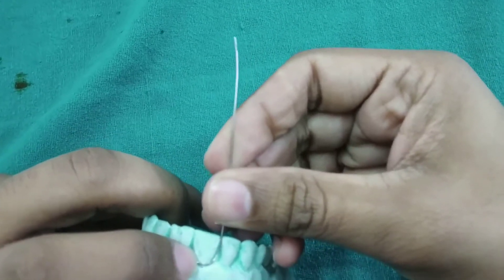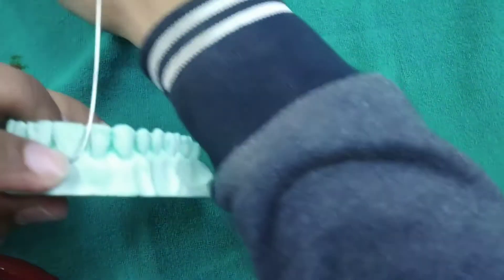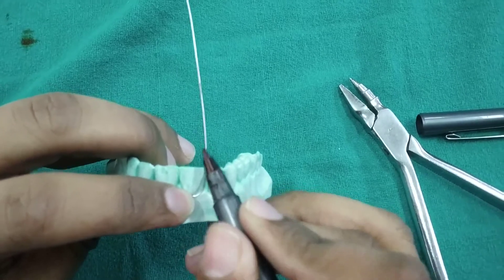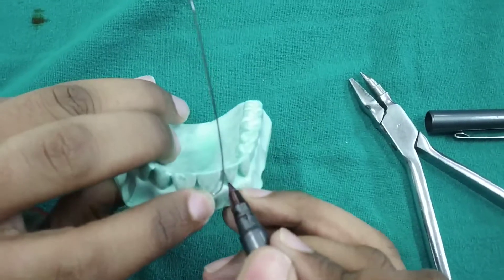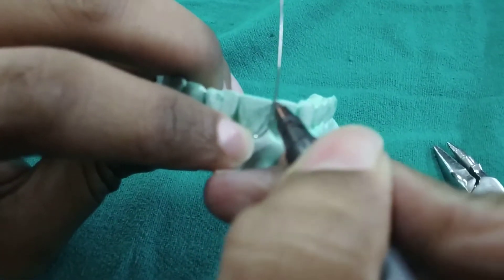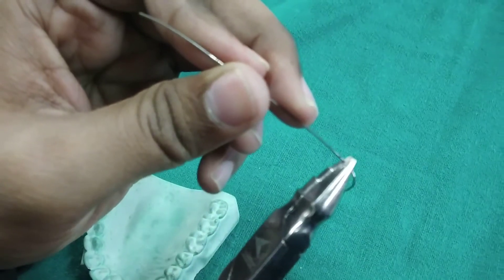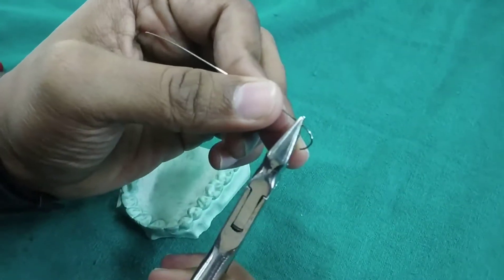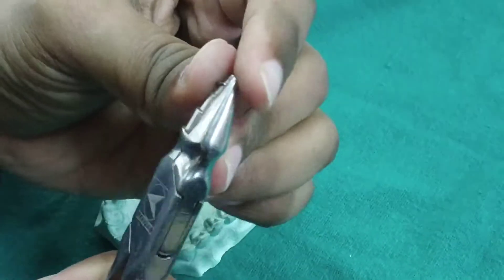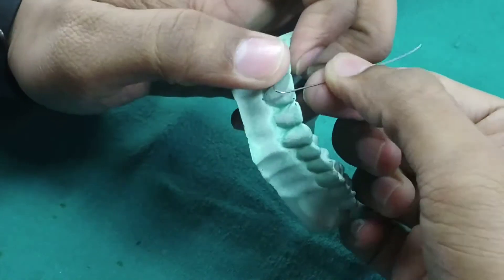Now the wire has been adapted to the cervical line of the tooth. Then we will give a sharp bend on the wire and we will mark it. Give the sharp bend and then adapt to the palatal surface.